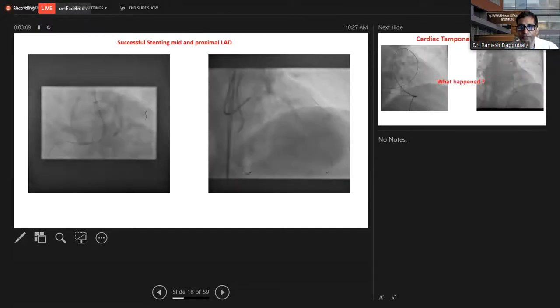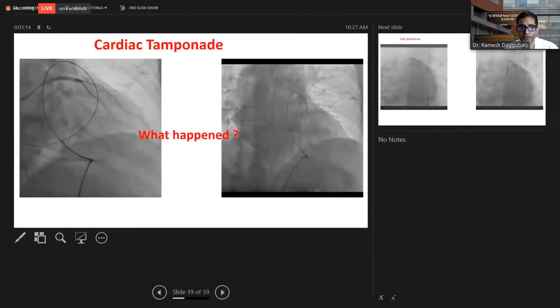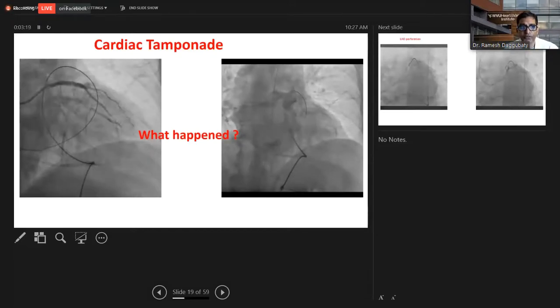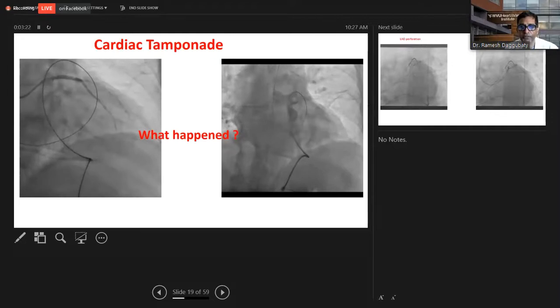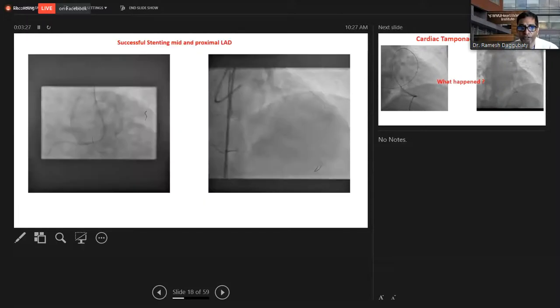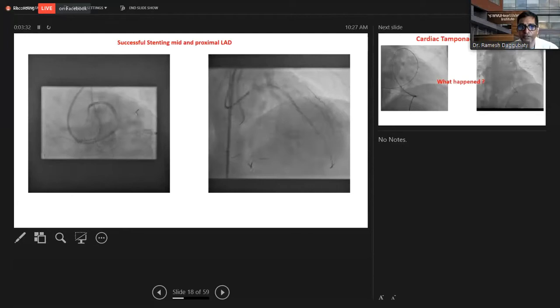And as you can see in the next picture, there is maybe some weakness in the LAD, there is some blush that is ongoing. So this continues to go on and results in cardiac tamponade, and the patient actually had a pigtail catheter and drain. So I'll go back one slide and show it to you. Here is the LAD that is performed quite well in the caudal view. If you pay attention, just at the bifurcation of the diagonal and LAD carina, there is a blush right there.